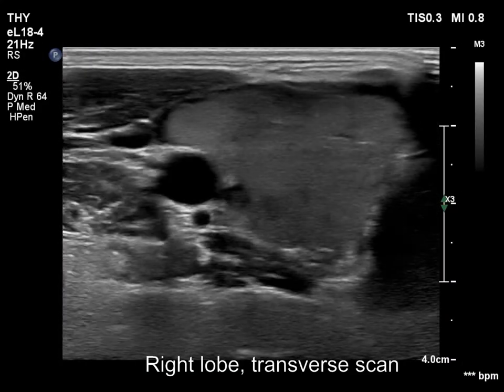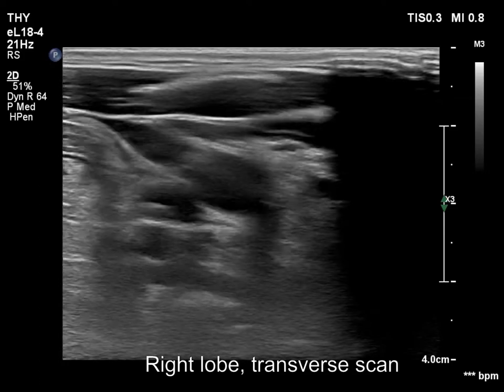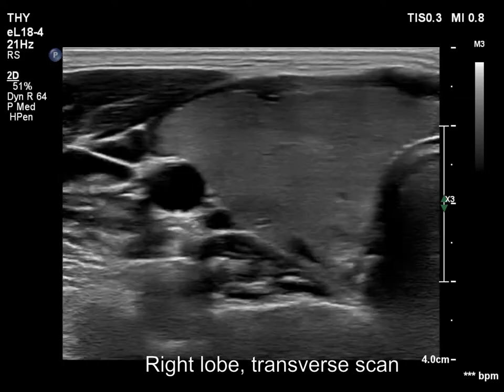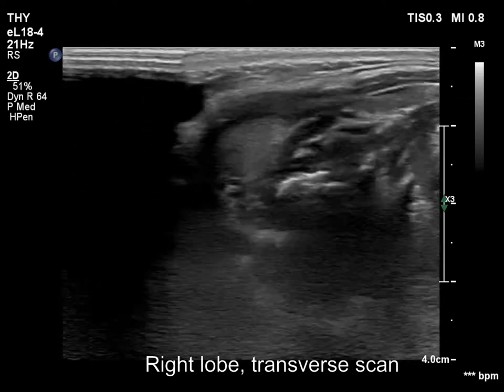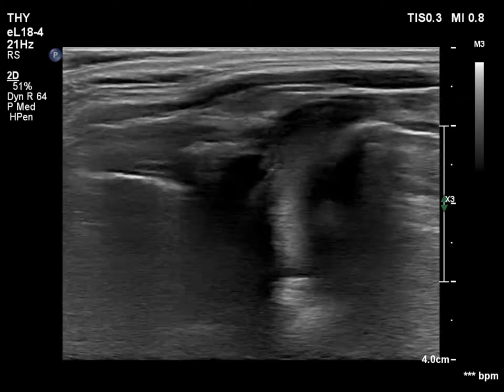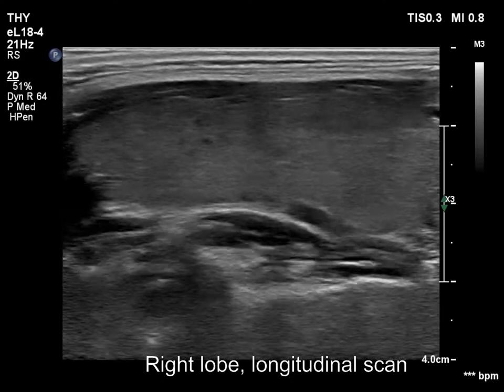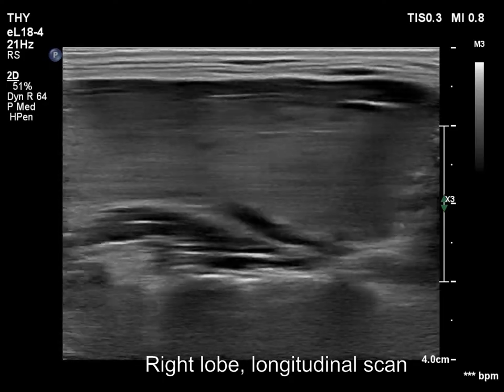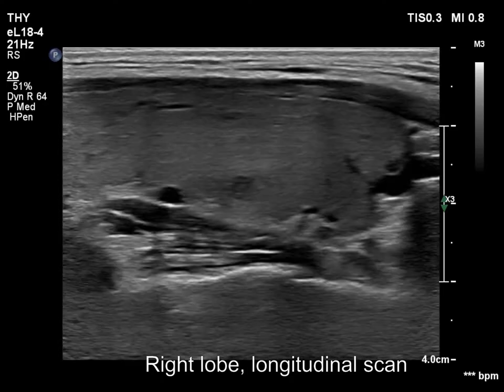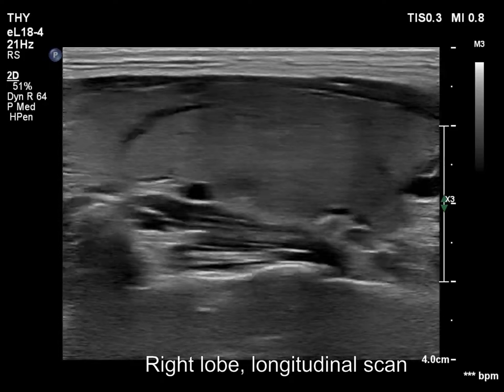The right lobe is echonormal. There is no discrete lesion within the lobe. The lobe is enlarged and has several tiny cystic areas. The lower pole is clearly visible.